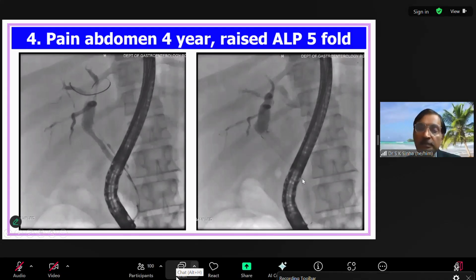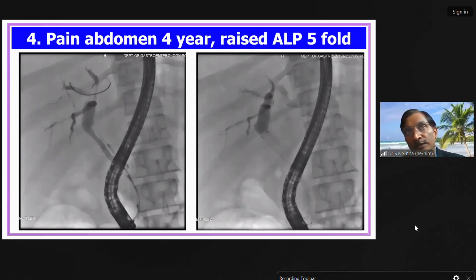So what happens is that metal stents open in two steps. One is immediate opening, that is because of the constraint. And yesterday in the last class we were talking that this nitinol has a very strong thermal memory. So as it achieves a temperature of 37, 38 degrees, the core temperature of the body, it starts taking the original shape for which it has been designed, and then it starts exerting the radial pressure.